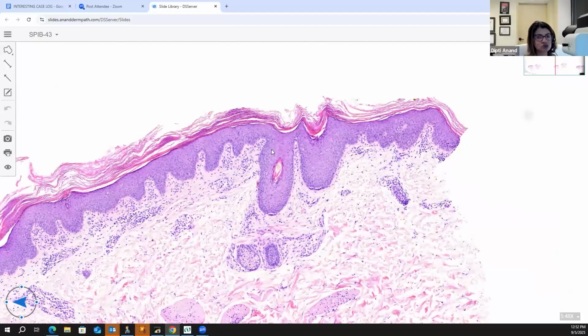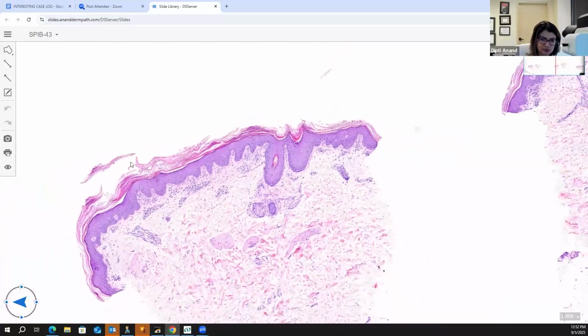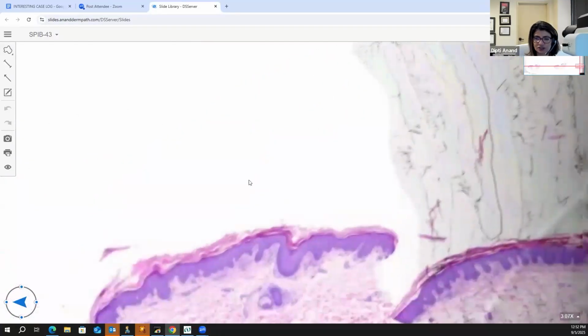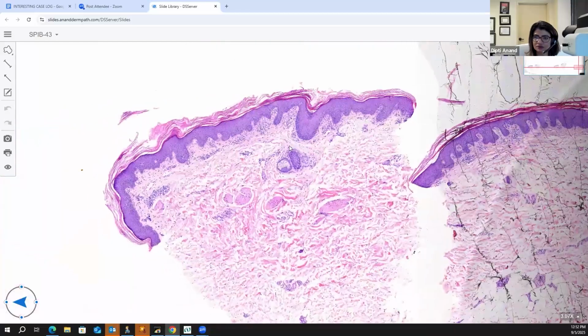So I want you guys to understand why this is not PR, because I do see why you would think about it because of these mounds. I'm putting a complete section in here. Do you guys get that now?